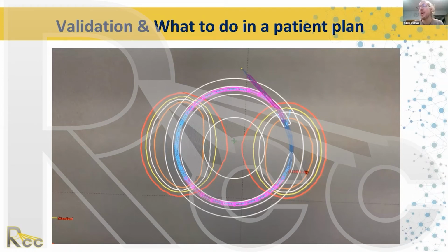For your system, it might be you can't use the first 3 millimeters of dwell positions, and you have a 3 millimeter offset. Correct reasoning, Ben.